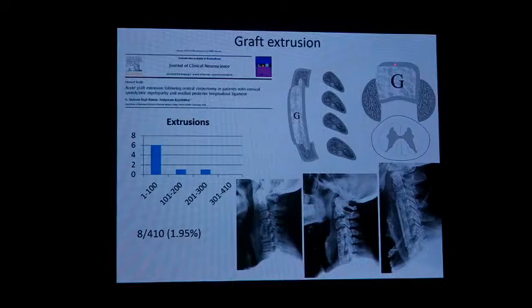So you have cortex here, a cortex here and a cortex here, but this part is cancellous bone. So you need to turn it around in this fashion so that you will have cortical bone on the ventral and the dorsal aspects. Otherwise, if you try to put it in the other way around with the cancellous bone here, it will not be retained in what you call the mortise. This is a mortise above and this is a mortise below.